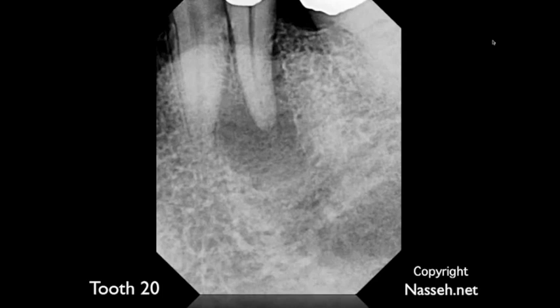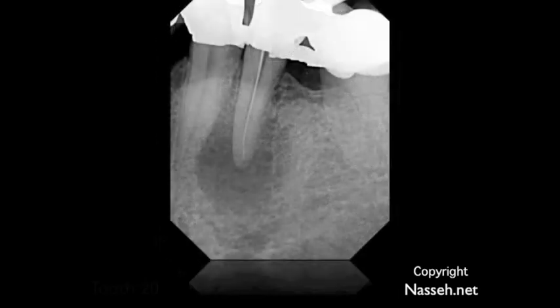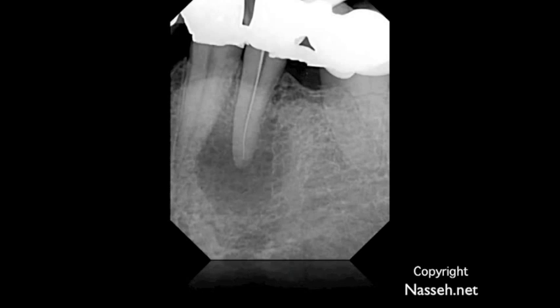So it's very important to communicate that with your patients ahead of time. This is the file shot. Patency was obtained. In this particular radiograph, I am deliberately about a millimeter short of the apex. I try to instrument these cases all the way to the radiographic terminus and make sure that I always have patency.